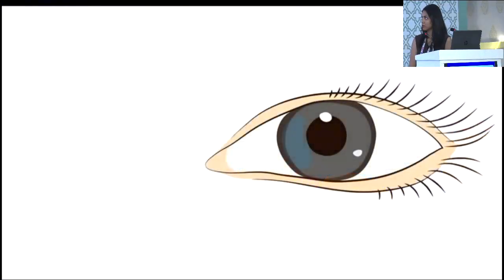The standard method of applying fluorescein dye is through a sterile, single-use fluorescein-impregnated paper strip. Saline or 0.5% proparacaine is placed onto the tip of the strip. Any excess dye on the strip should be gently shaken off to prevent overstaining before applying it to the lower palpebral conjunctiva.